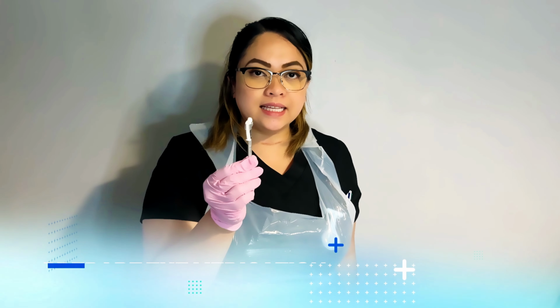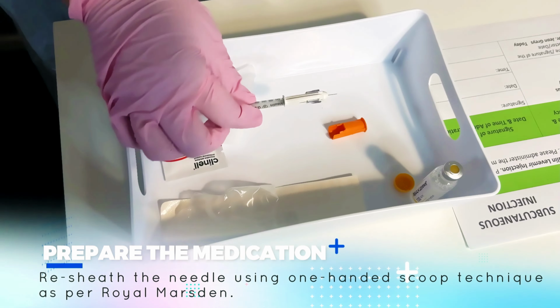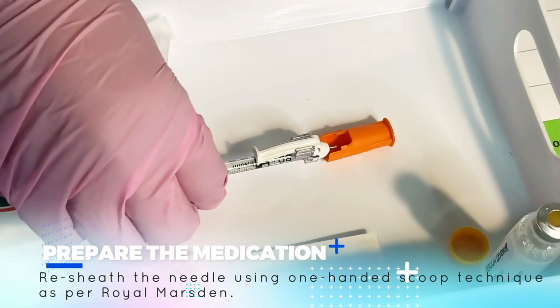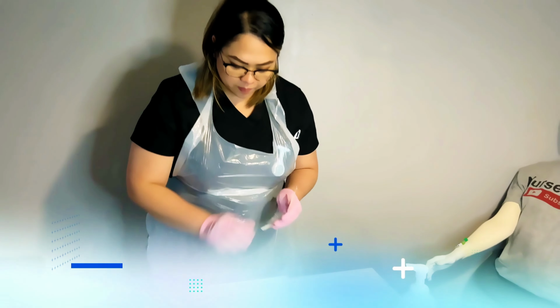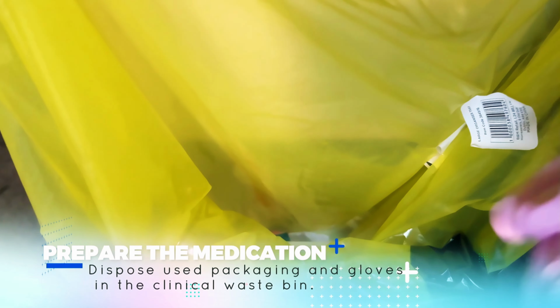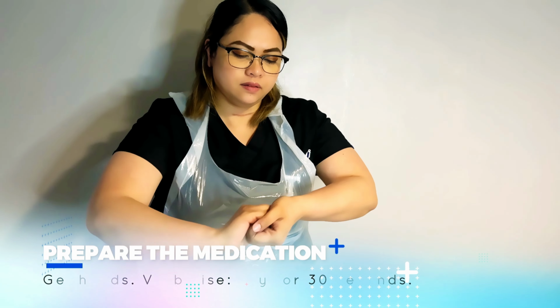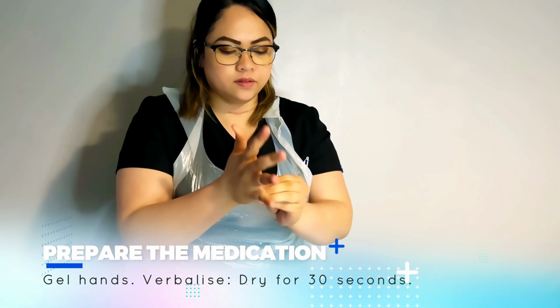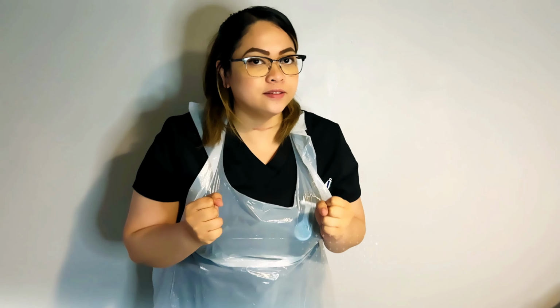I have to resheath this one using a one-scoop technique as per Royal Marsden, okay? So I'm gonna remove now the packaging. There you go. Remove my gloves. Then let it dry for 30 seconds. I'm just gonna get another pair of gloves.